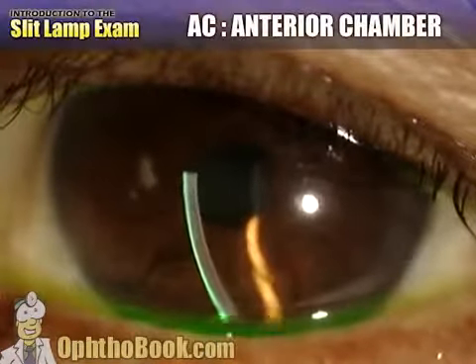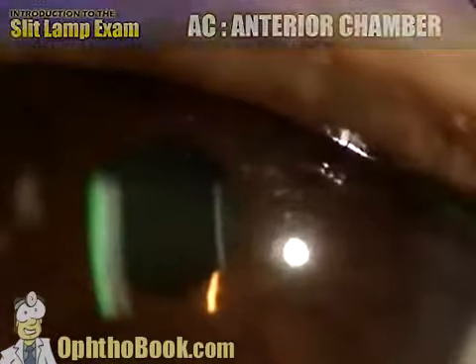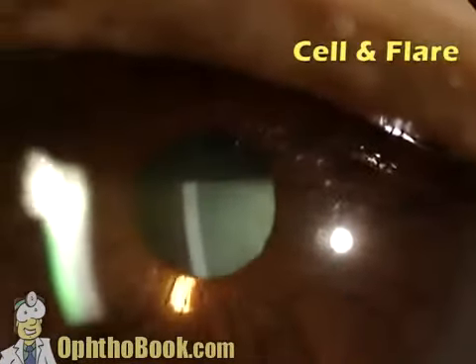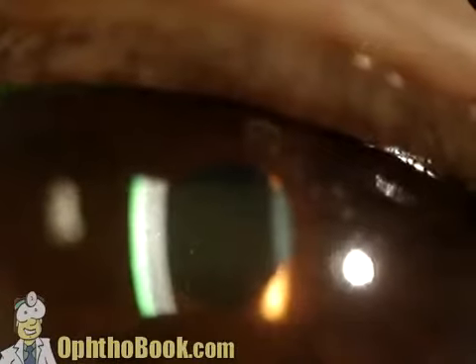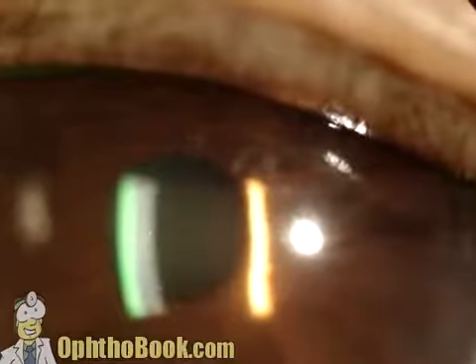This is the anterior chamber, and when looking at the anterior chamber, make your light beam shorter, a little bit thicker, and turn the intensity as bright as you can. And you'll see cell and flare. Cells are individual cells floating in that potential space there, and flare is that sort of foggy appearance from protein released from inflamed blood vessels.